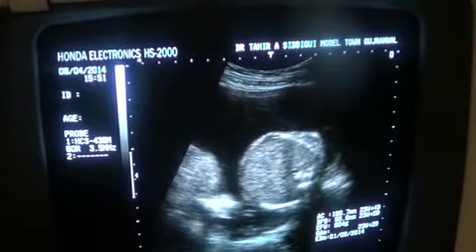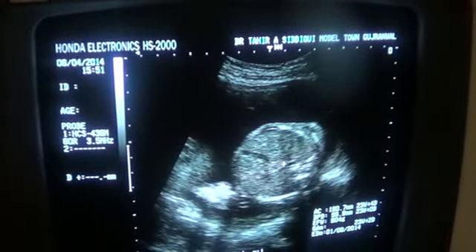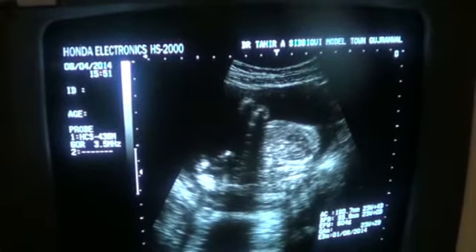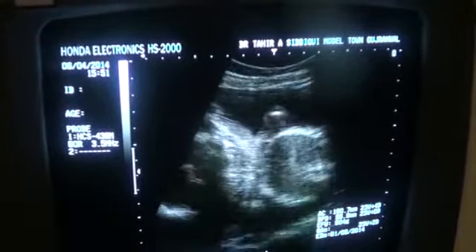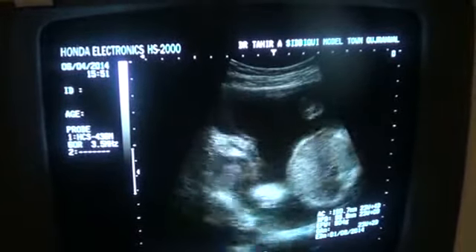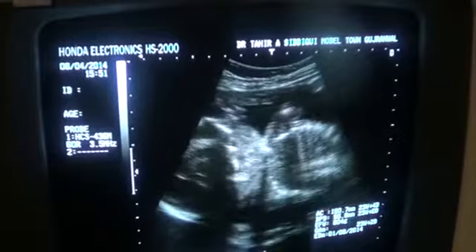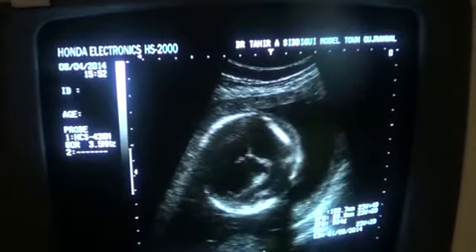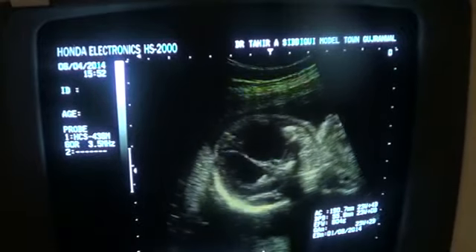Now in this fetus, this is the vertebra, this is the umbilical vein, and here you can see a kidney shadow in transverse section. This is the kidney. In this fetus, the head is cephalic in presentation. You can see the dilation of the ventricles. Here we are. This is a case of hydrocephalus.